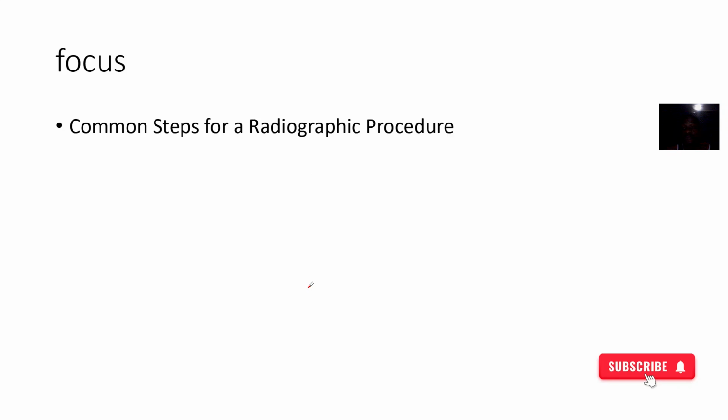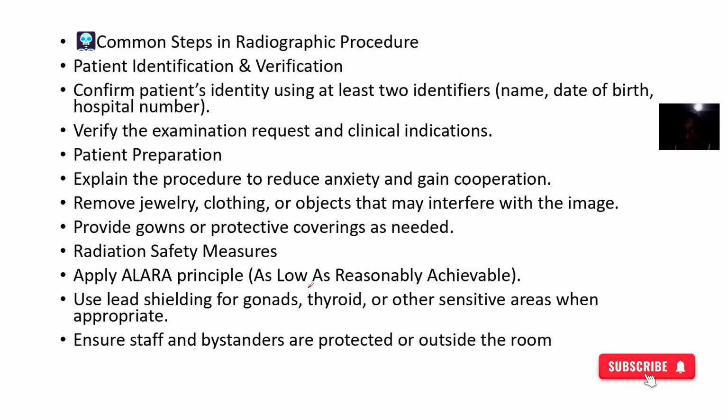So the common steps for a radiographic procedure include, first, you have to identify your patient and verify your patient. You have to identify that they sent the right patient to you and the imaging they are requesting is the right thing they are requesting.